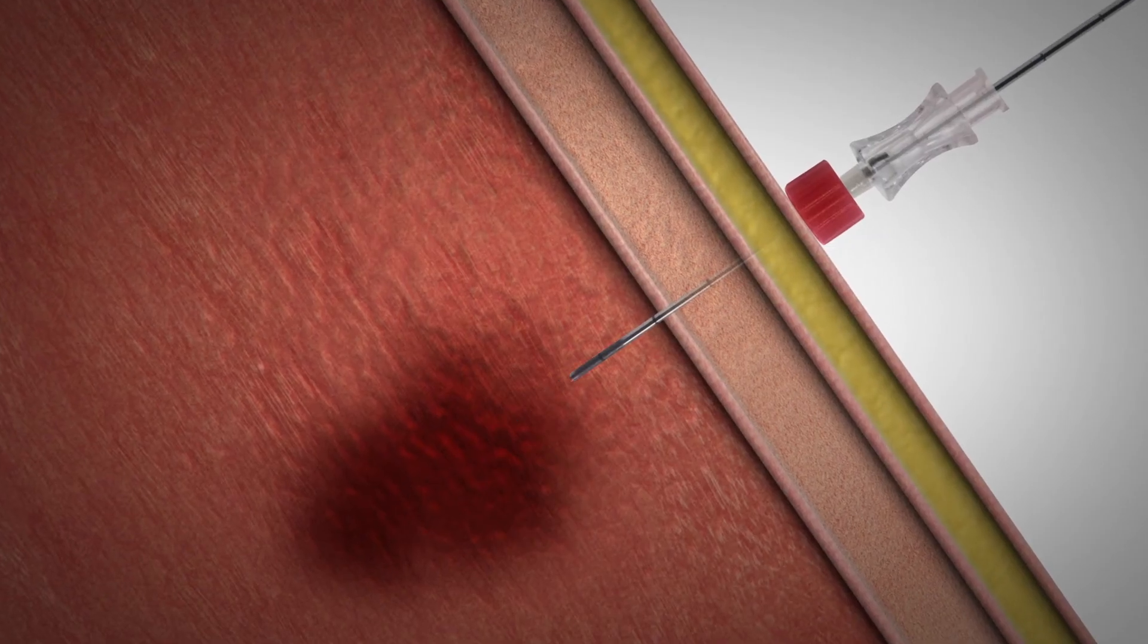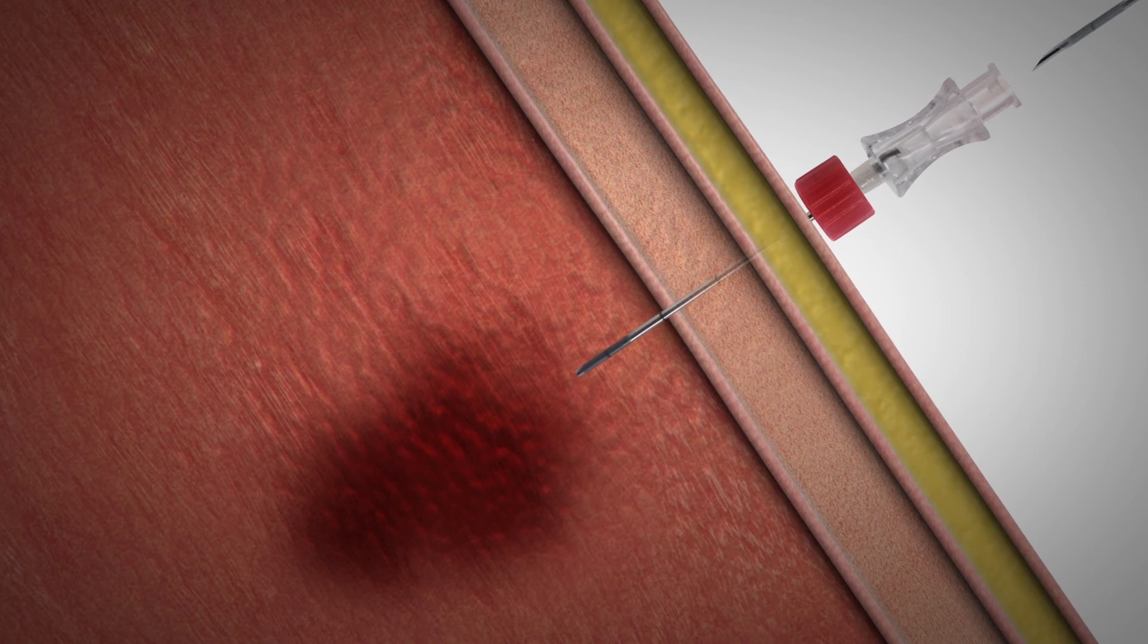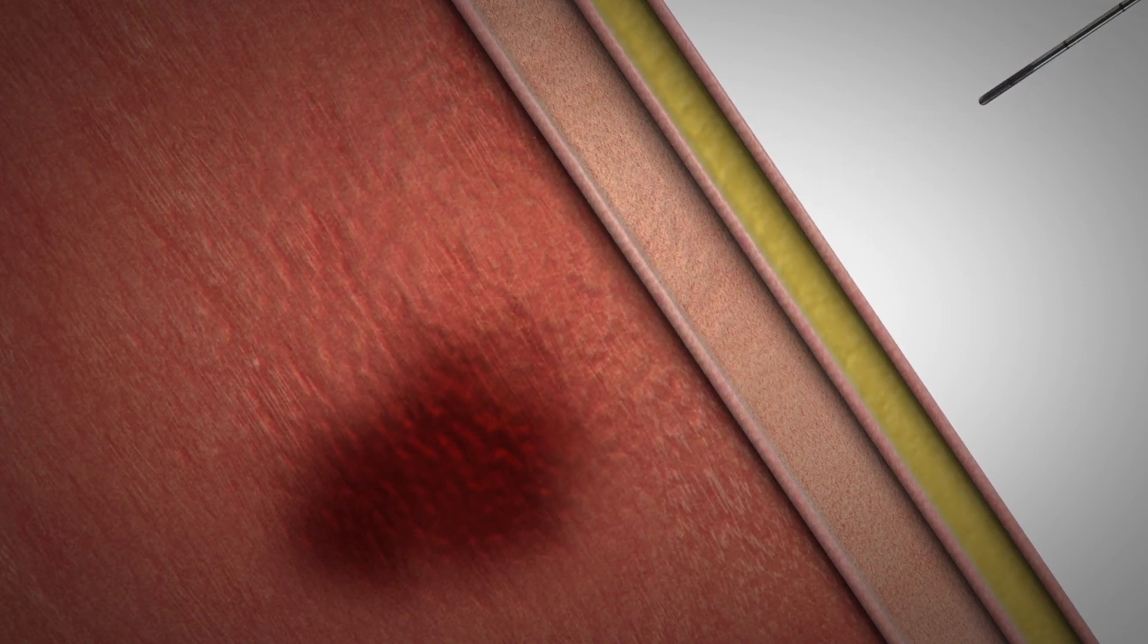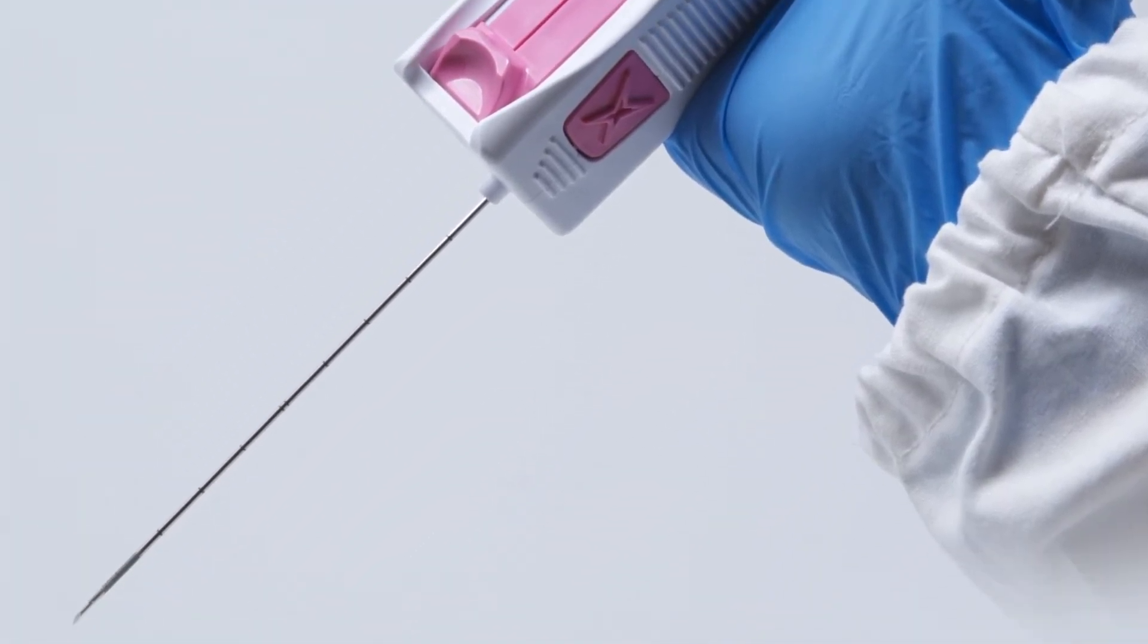Extract MedOne gently out of the coaxial needle and pull back the loading lever once to withdraw the cannula and expose the sample specimen.